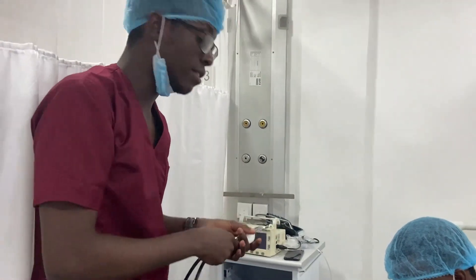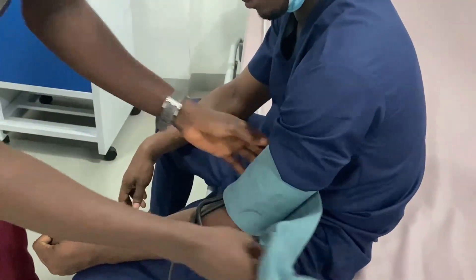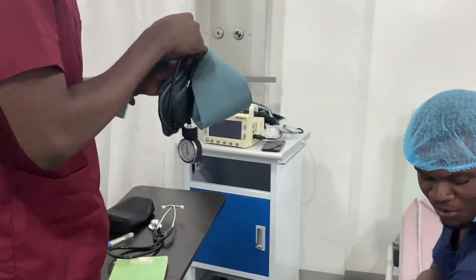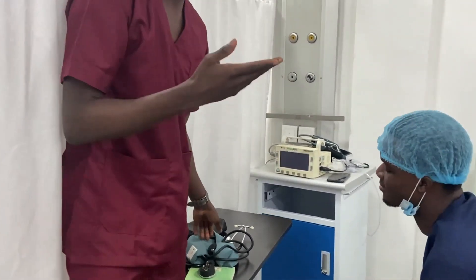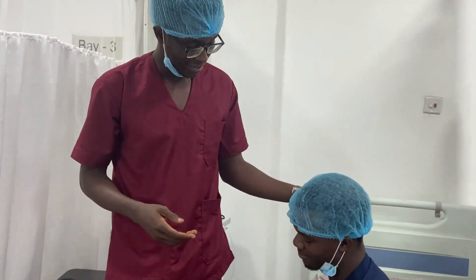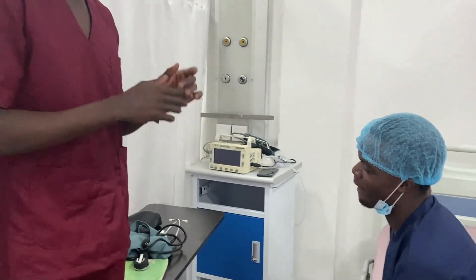Thank your patient, remove all the instruments and equipment. Tell the patient their blood pressure: 'Sir, your blood pressure was 120 over 80, which is perfectly normal.' Next, you will take the pulse.